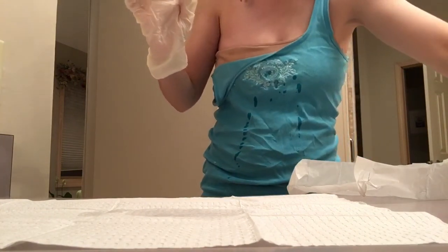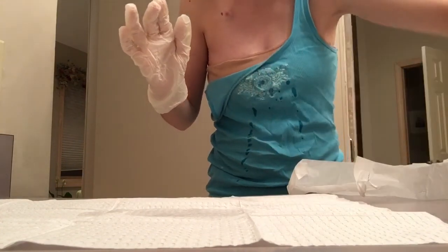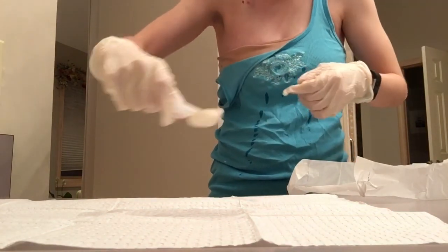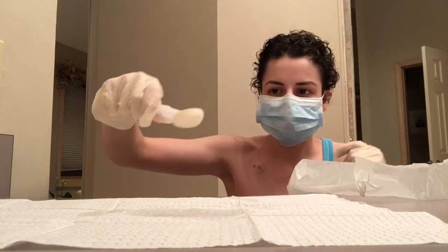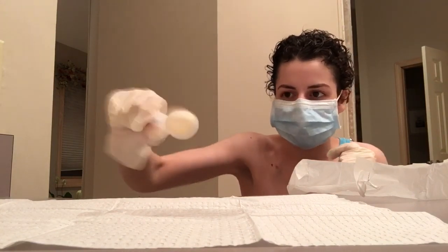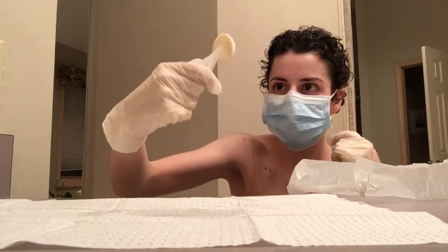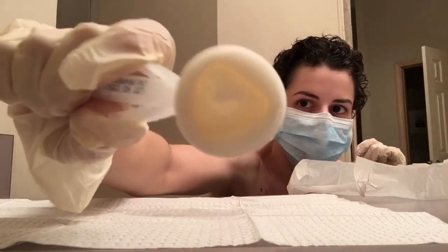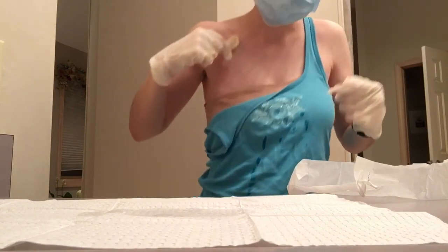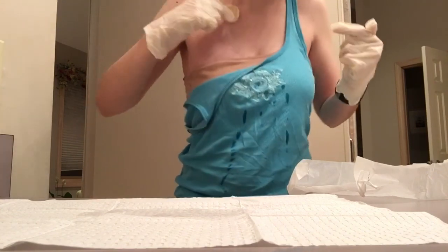So now I have my kit, which I can pick up from the inside, so you can kind of see that it's sitting right here. And I'm just taking out this, I like to call it the Swiffer, because it looks like a Swiffer picker-upper thing. And just pull down this, you shake it. Make sure it's really wet. Looks nice and wet. And then it looks like my shirt is coming down, but I just have tan clothes underneath it, so it's fine.